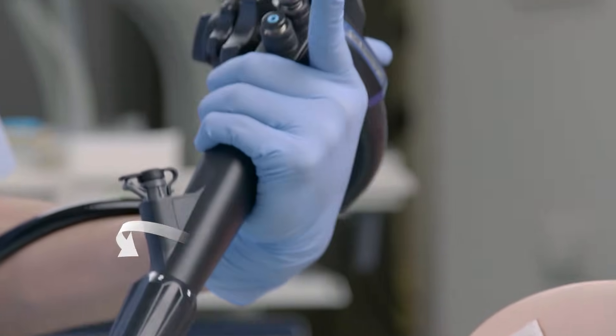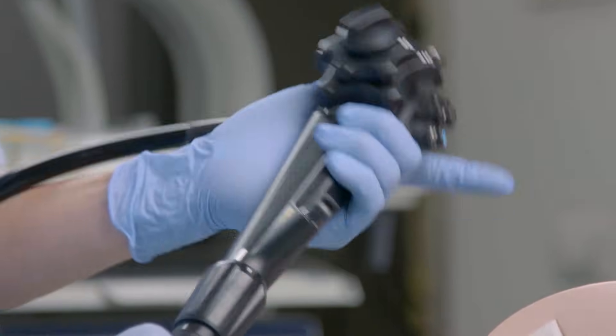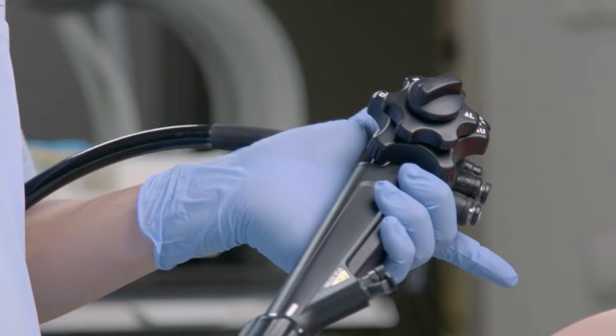By twisting your left wrist perpendicular to the axis of the colonoscope, you will easily achieve the right and left movement of the insertion tube.